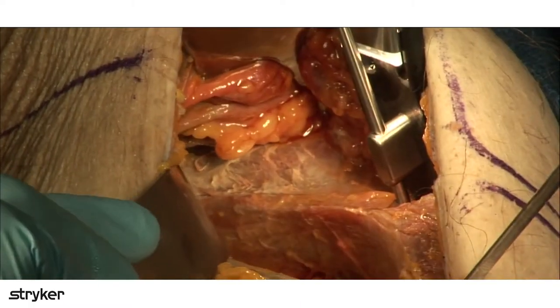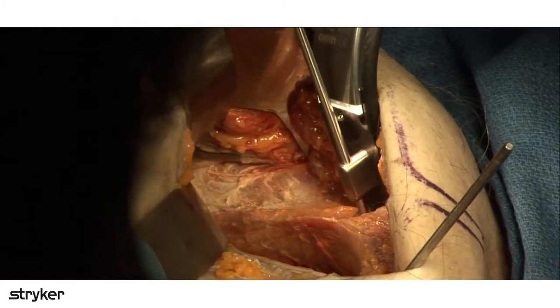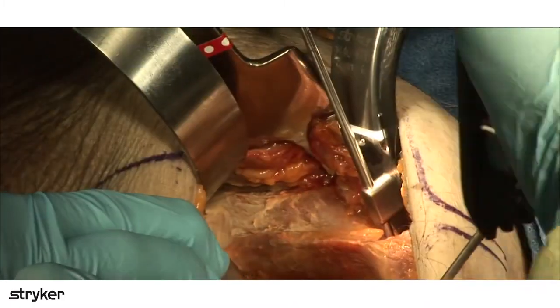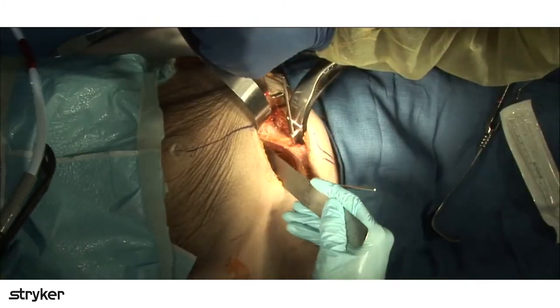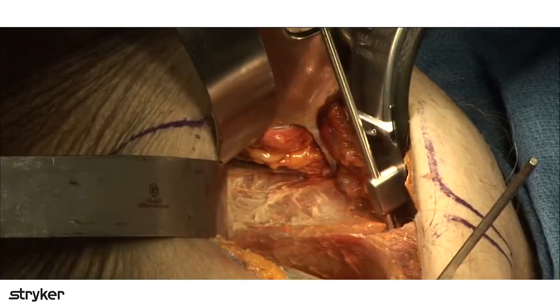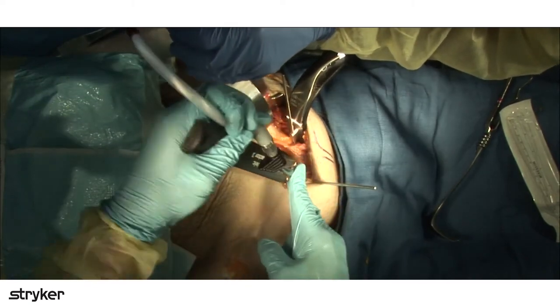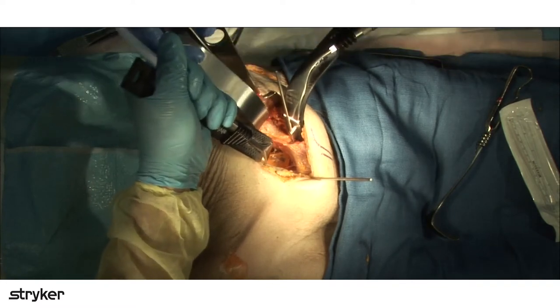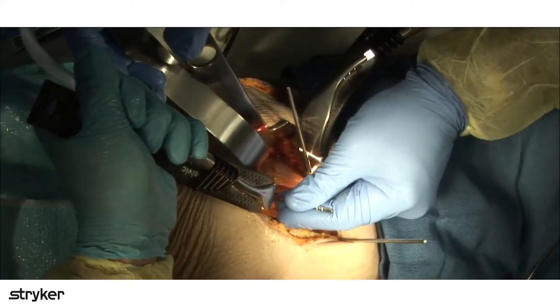That's actually pretty good right there. That's nice. All right, so this is the point at which you're going to take this neck. You've got a couple of options here. You can use a malleable retractor, and you can just slide it up and pull it up like this. The other option is you can use that number 3 retractor and slide it up in the same position, just lateral to the sacroiliac joint. And so this retractor is placed underneath the iliacus muscle.